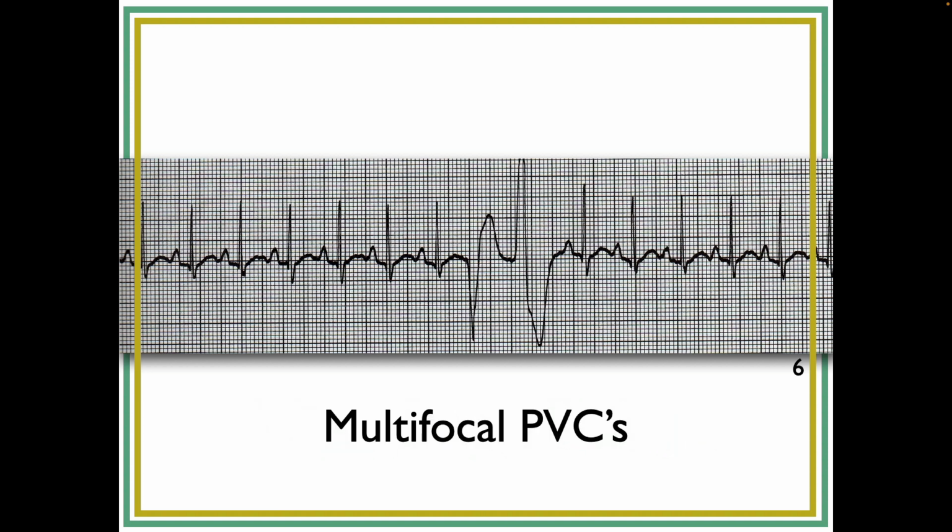Yeah, so let's look at this. In this particular case, each of these PVCs is made up of a QRS and a T wave, and that's all there is. The first one is a negative QRS. The beginning of it's here, it goes down here, the J point is here. So this is the initial QRS, and then there's a T wave. And then it goes right into the second PVC right here, and the QRS is flipped. This one and this one are very similar, it's just that the second one is an upside down version of the first one. So in this one, the QRS is just one big negative deflection. In this one, I've cut off the top of it, but the QRS is just one positive deflection. The J point's right about here, and it's an inverted T that goes like that.